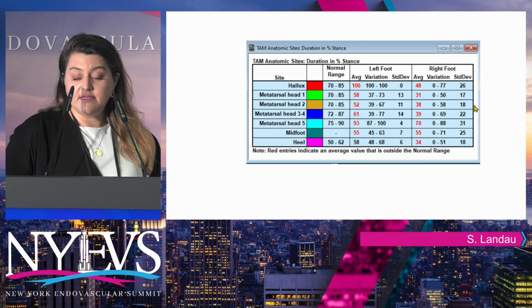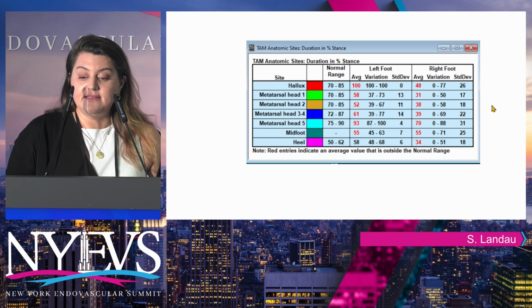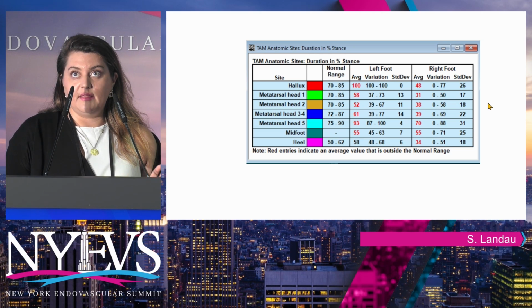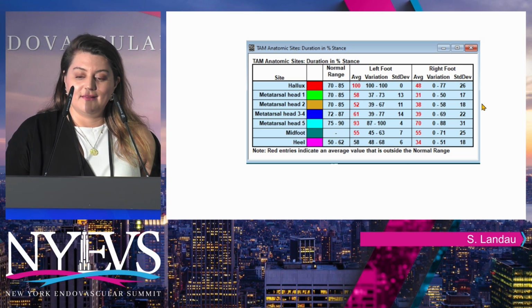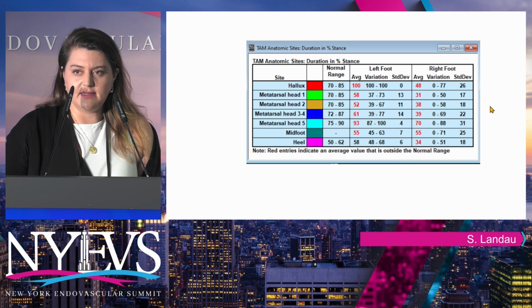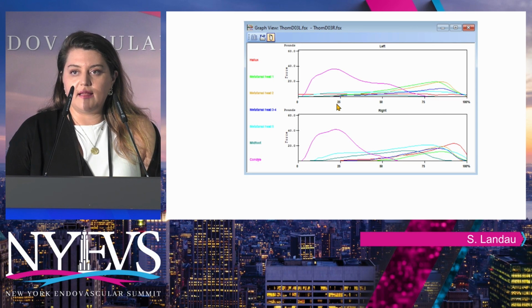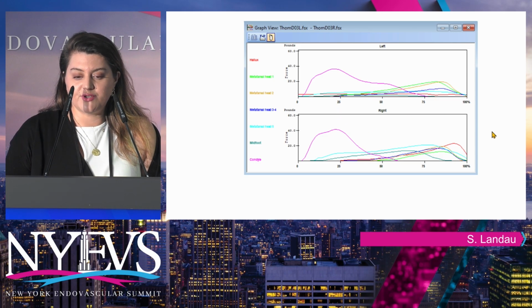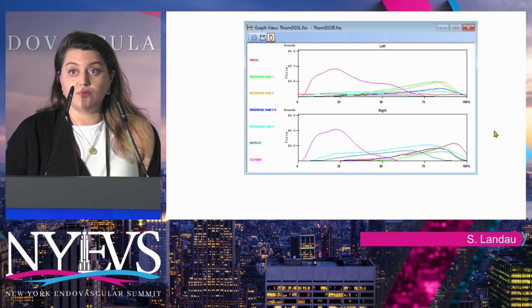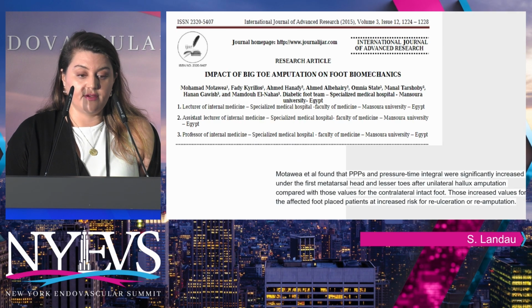But what the toe filler did do, that ideally I would have wanted to incorporate both, is that it made the left limb appear longer than it did, and it made the timing of both of his limbs more symmetrical, which is also a goal. So his heel symmetry and limb length symmetry was the best with the toe filler, but the custom foot orthoses was the best overall because it reduced the left forefoot pressure the greatest.